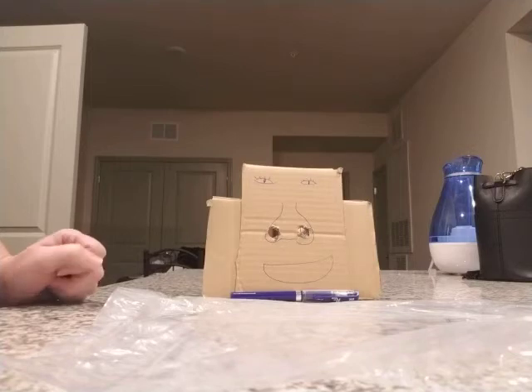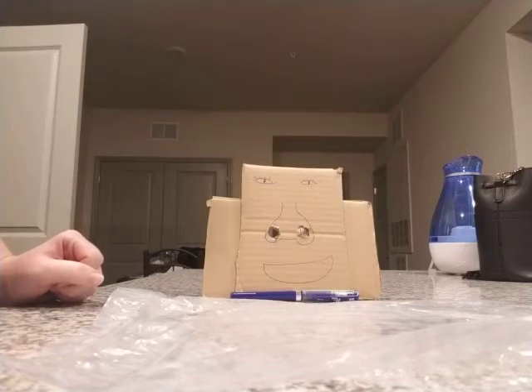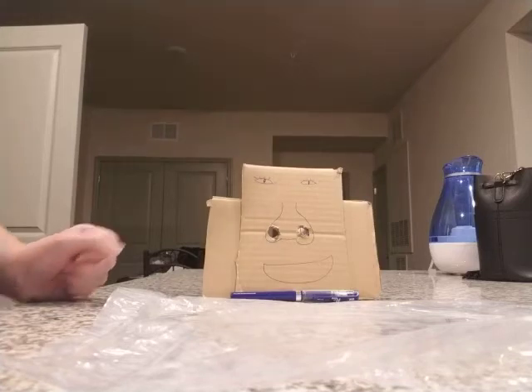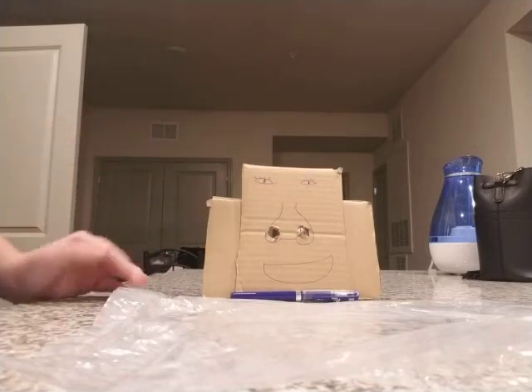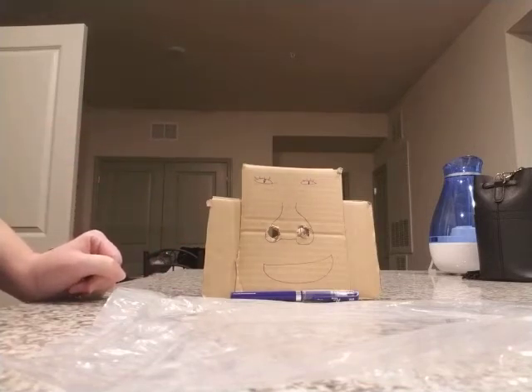and we're going to assess the patient's level of consciousness, ability to cooperate, and their ability to move into the correct position. I'm going to assist the patient into high Fowler's. This is Gladys. Hello. And I'm going to assess their pulse ox and vital signs and record that information.